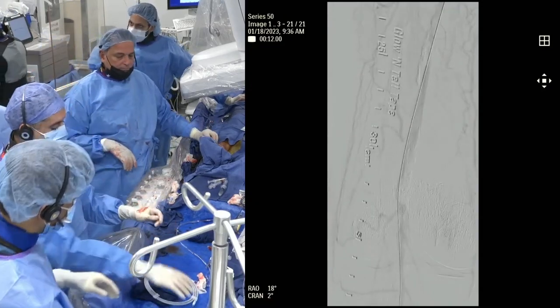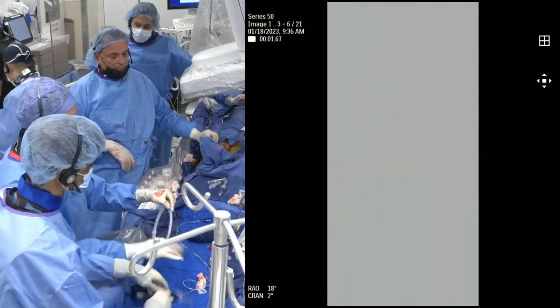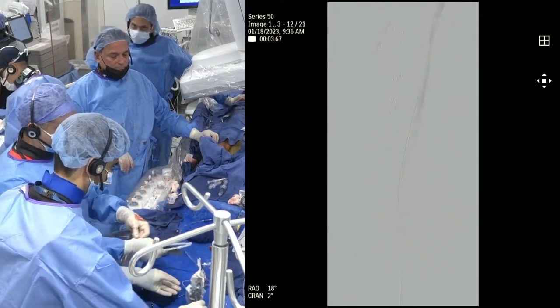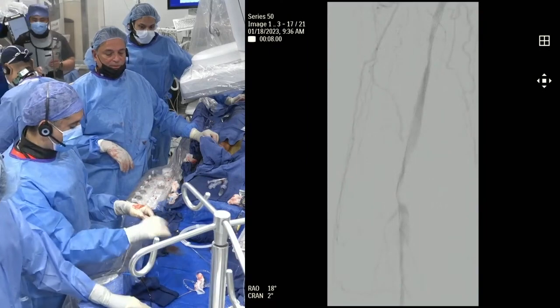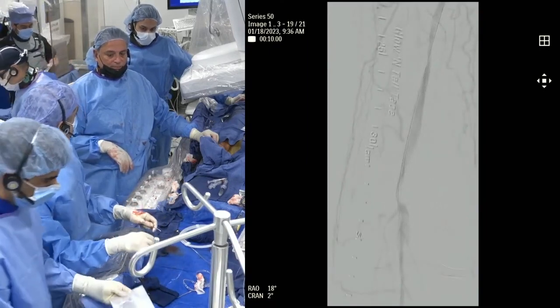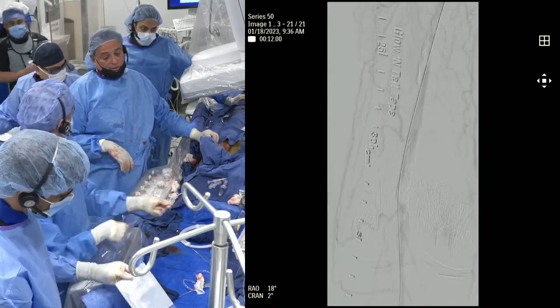Because you don't want your stent not to expand and then you can't track anything and end up in a bad situation. That's a 6-0, yeah. Yep, 100%. That's a 5-0 you have to get. All right, let's just shockwave the common femoral. So what we do is shockwave, you DCB the common femoral, and then you do whatever distal. So this is a good question.